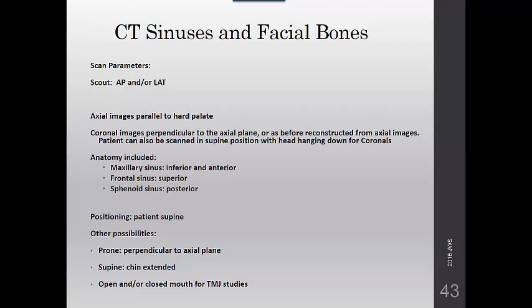There are differing opinions in the textbooks that we have. DeMaio advocates that the sinuses should be scanned in the axial plane parallel to the hard palate. Roman advocates that they should be scanned in the coronal plane. So with the new multi-slice scanners, either method is acceptable because the technologist can reconstruct either axial or coronal images from the prospective images that are obtained in whichever plane they were obtained in.